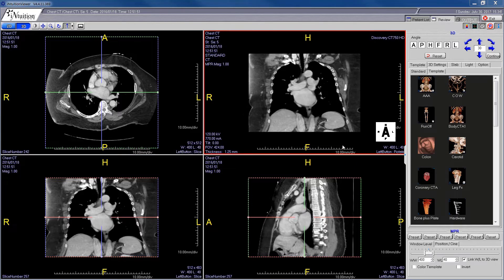There is an additional window in the top right corner of the viewer — we are going to ignore that for now. We are going to go through some of the basic ways to interact with these images, starting with the axial images.